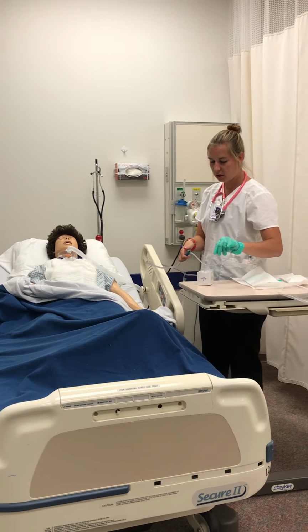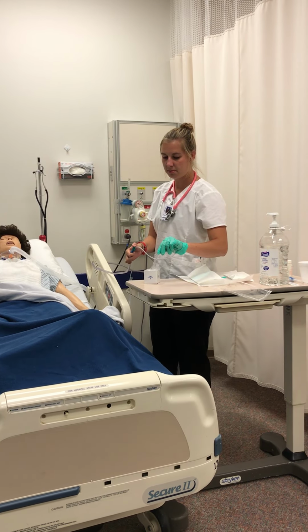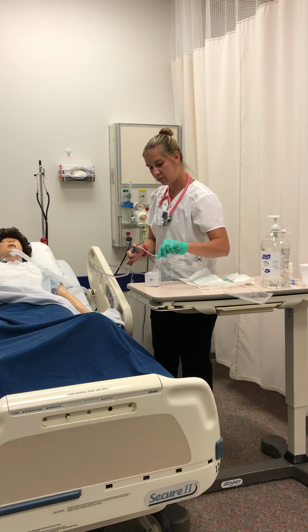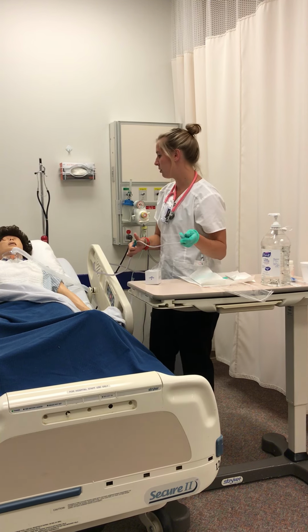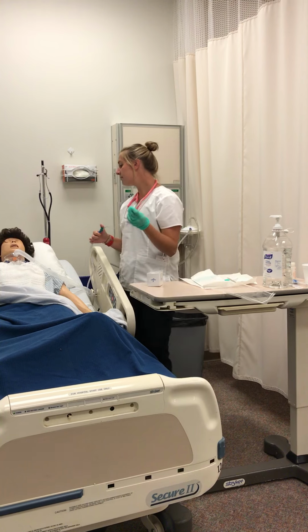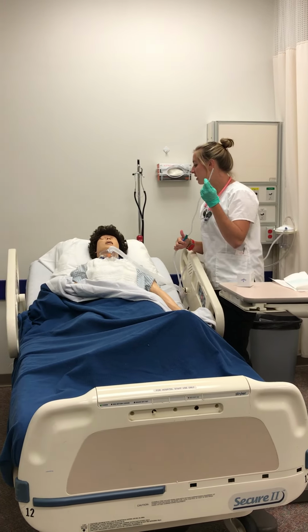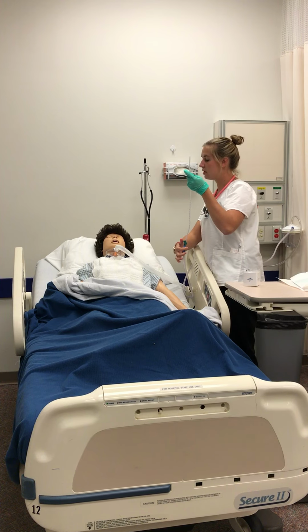I'm going to suction more saline solution to wash away the mucus that was sucked up. And I'll wait 30 seconds before suctioning again. Gretchen, if you want to take a couple more deep breaths, we're going to do suctioning. Great.